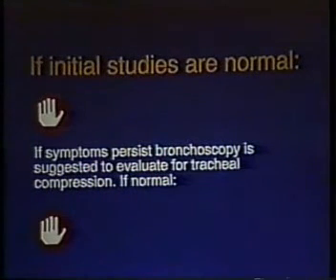And I believe that an esophagram should be performed as the initial evaluation of all these patients. Now, if the frontal and lateral chest radiographs are normal, your high kV film of the airway is normal, and your esophagram is normal, the universal sign is that of stop. I believe that nothing needs to be done. The patient is finished.